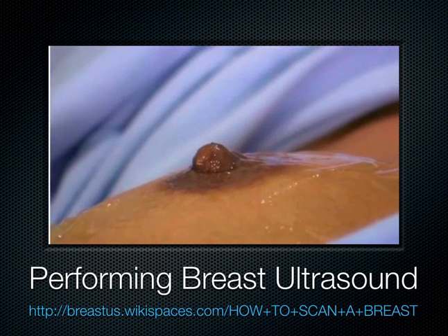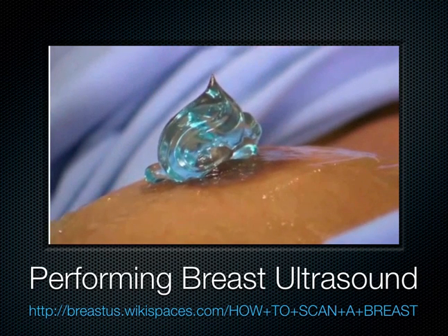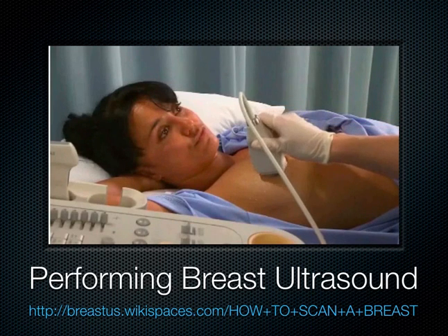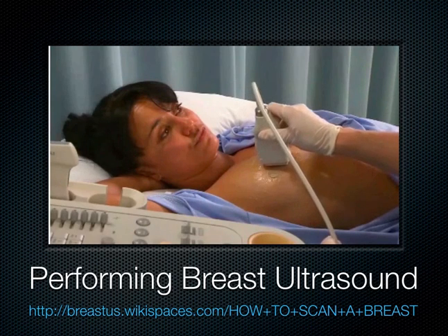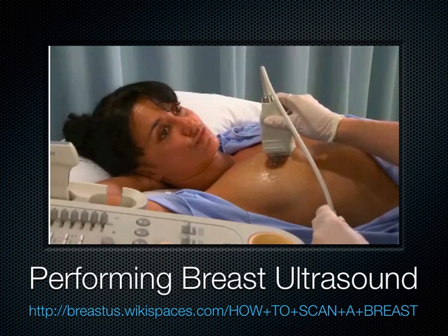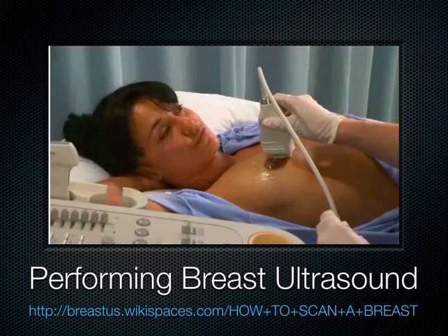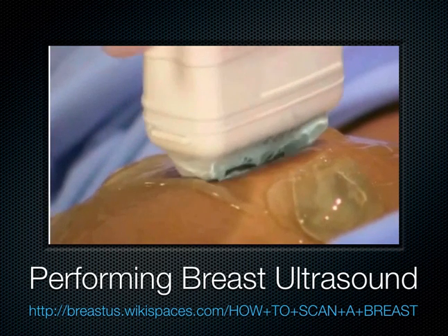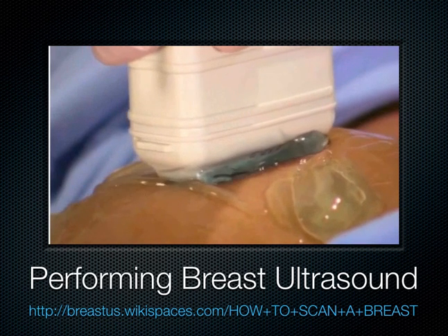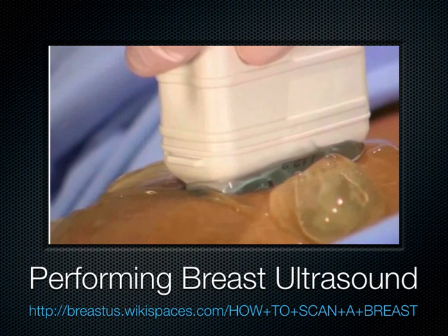To scan the nipple and areola, place a generous amount of acoustic gel directly onto the nipple. Place the transducer to the right of the areola in the longitudinal plane. Scan the area from the right of the areola, over the nipple, and just beyond the left of the areola. If any pathology is encountered, measure the length, height, and width of the lesion. If no pathology is encountered, return the transducer to the midline of the nipple in the longitudinal plane.